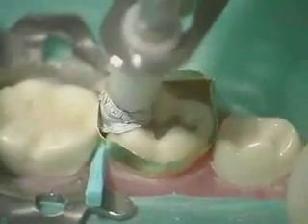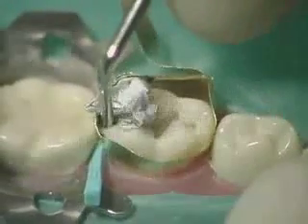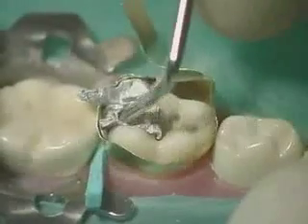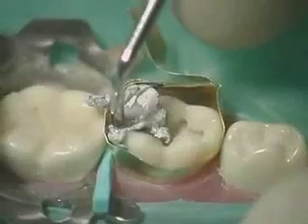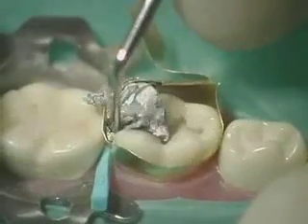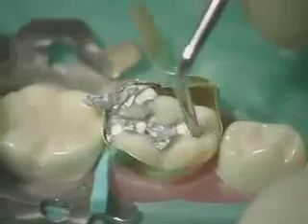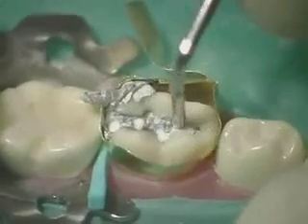Mix the amalgam and load the carrier to place the amalgam. Begin condensation in the proximal box using the small end of the spoon excavator, initially pushing down into the gingival floor and then out into the matrix band to establish positive contact. Continue condensation on the occlusal surface, condensing into all internal line angles.